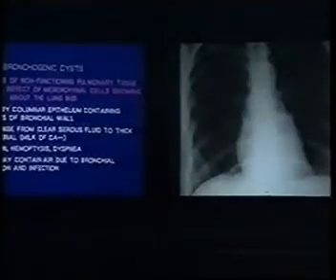And when we look at this with a T2 weighted sequence, we can see a very characteristic appearance of mucoid impaction within the airways. This appearance was actually first defined on MR by Dr. Gooding when he was describing mucoid impaction in patients with cystic fibrosis. The appearance is absolutely the same in this subpopulation of patients with bronchial atresia, and we make an unequivocal MR diagnosis in this case.